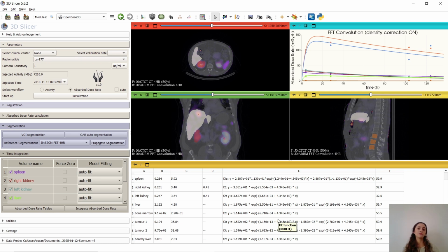So remember, this was just one method to perform your segmentation of tumors. There are other methods, of course, and in the future we are planning to do a more advanced video.